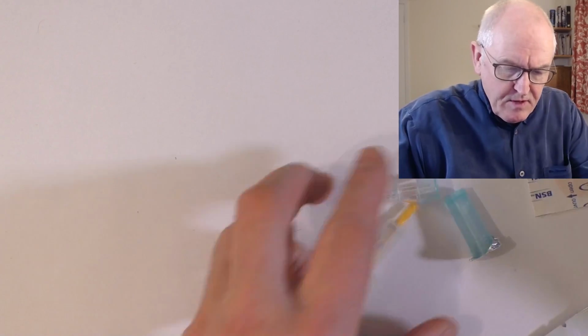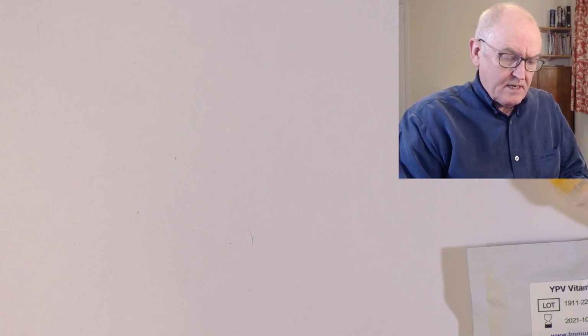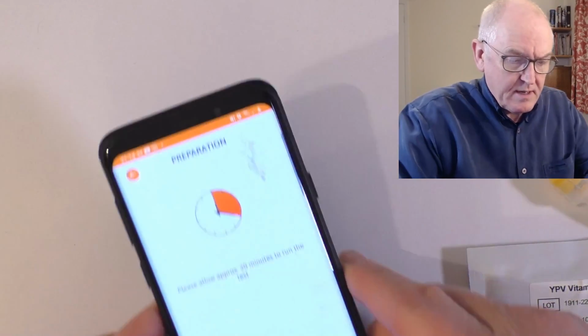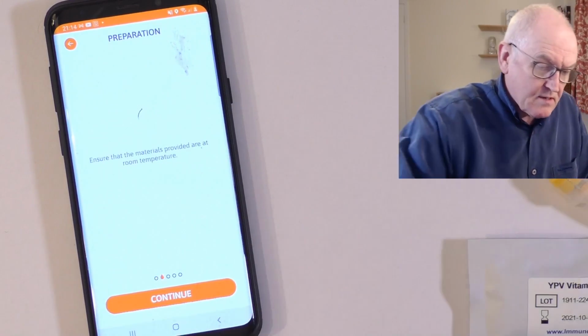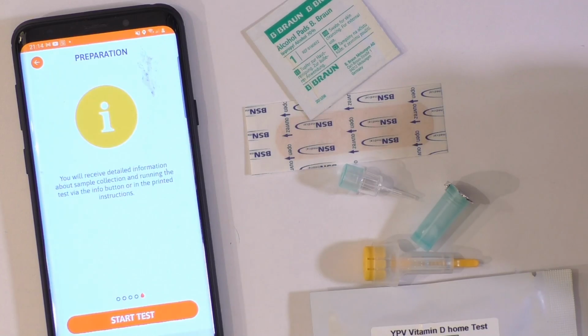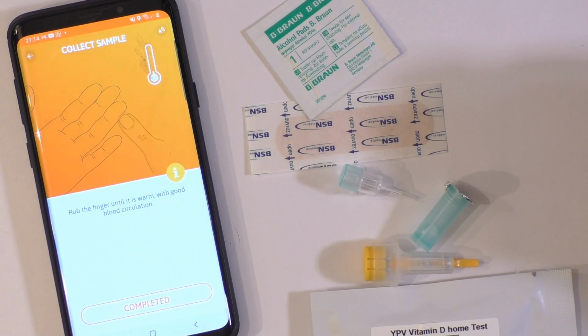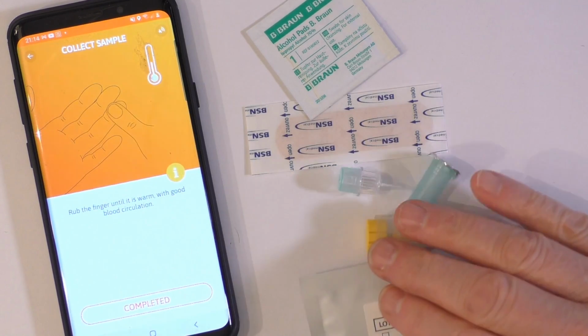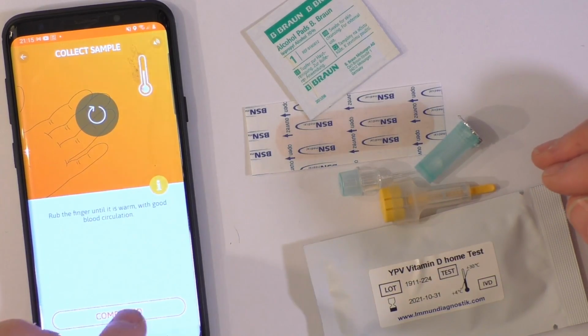Now, I'm not very good with mobile phones. In fact, I've had to borrow one for this occasion. It talks you through the test. So let's see where we're up. Yep, so I've already started. It says you'll need 20 minutes to do the test. So let's continue. Let's go, start test. Rub the finger until it is warm with good blood circulation. Telling me what to do. So my finger is warm, okay? Completed.